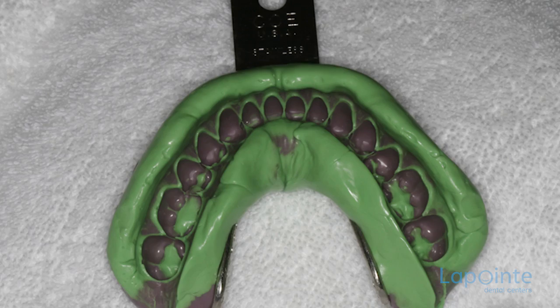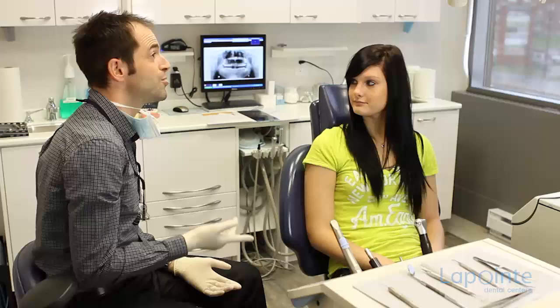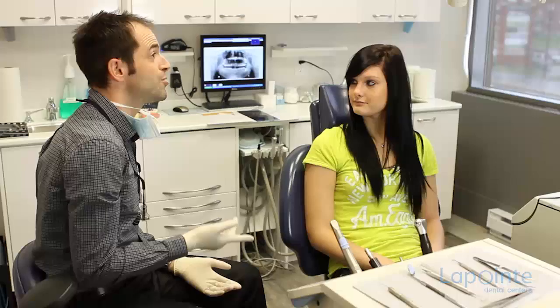The pillar teeth are then ground, followed by the final impression and then the installation of a temporary bridge. On the last visit, the temporary bridge is replaced by the permanent apparatus, and the choice of colour and shape is made taking into account the patient's opinion.